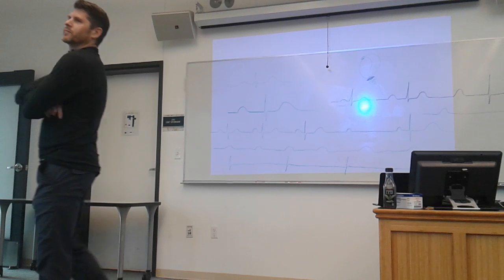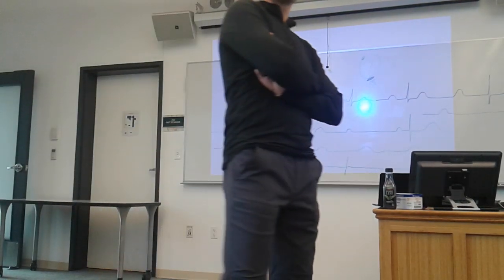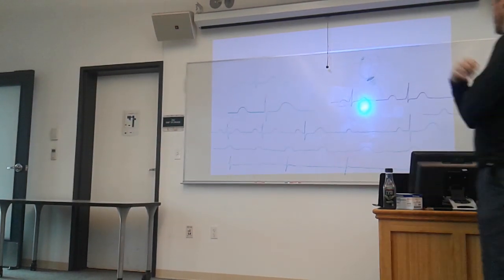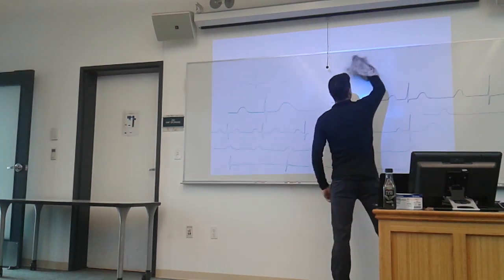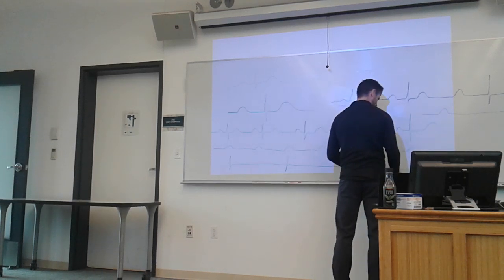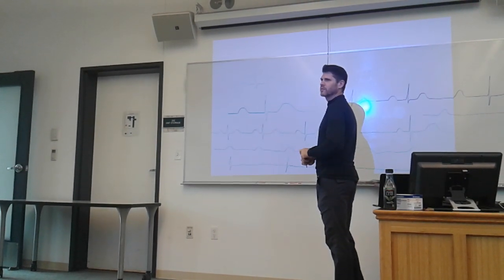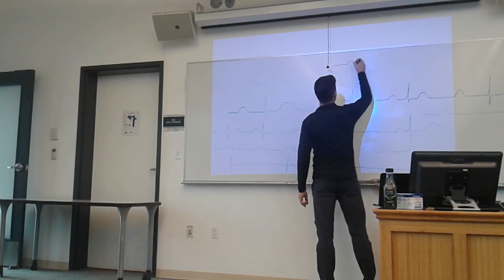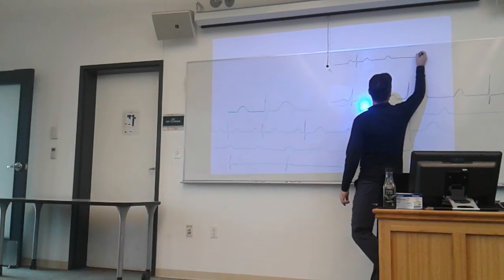I feel like it'd be some difference, but I don't see how. Are you just making a point that you don't know? Because the PR, maybe your PR is longer, like a long PR, and then every other is a dropped beat. Right? Because Shannon, are you the one that described that last one? Refractory. The one before that? Block would be the same thing as you described? Refractory. That's my thought.